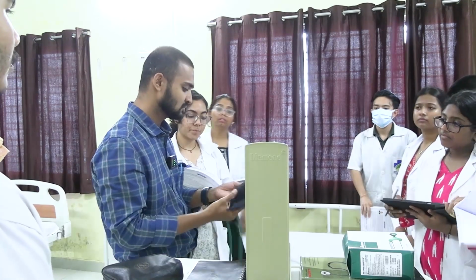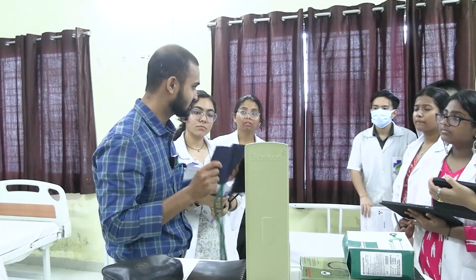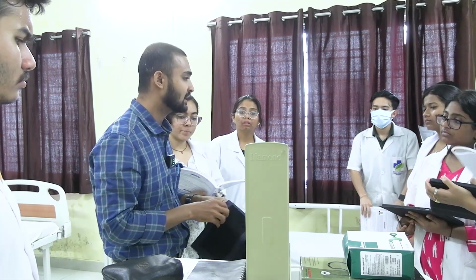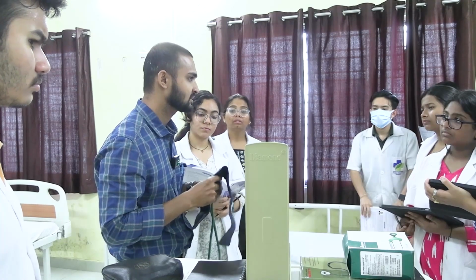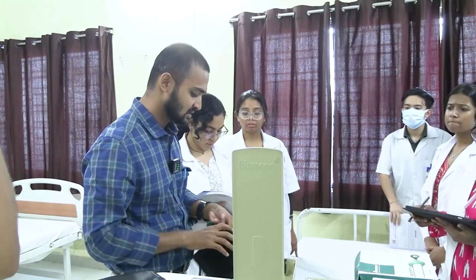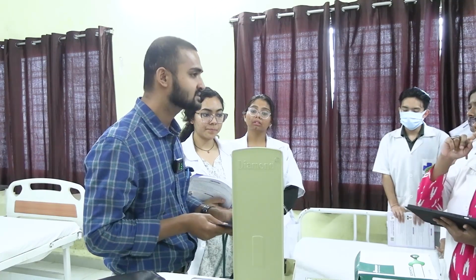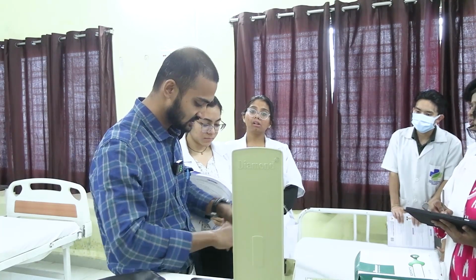The cuff is made up of non-distensible cloth, and the bag is inflatable. The bag can be inflated, but the cuff is not distensible. This way it balances the pressure. This will be inflated, and this will be non-distensible. So it is a flat, inflatable rubber bag inside the cuff.